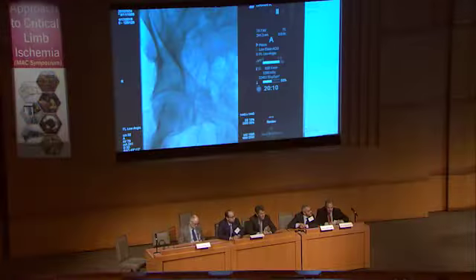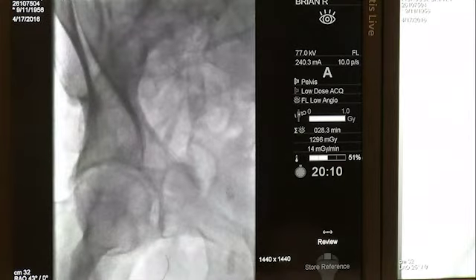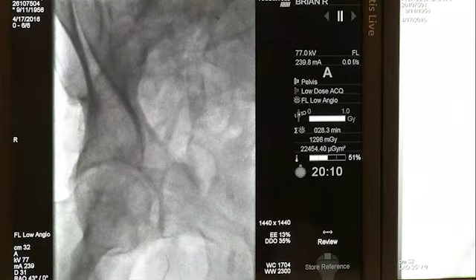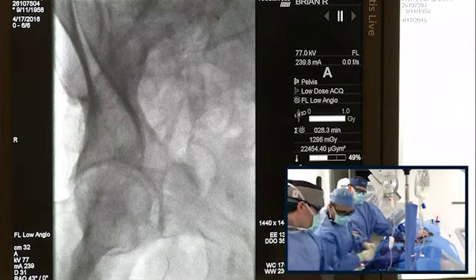So that sheath is stuck up there right now. We can't get it through now. We could get a 5 French sheath, but let me try this multi-purpose first, and then if this doesn't work, we may put a 5 French sheath just to be able to get some work done. But these are some of the issues. We tried different techniques, as I mentioned earlier, to get that sheath down, but we haven't been successful. So I think we need more support.